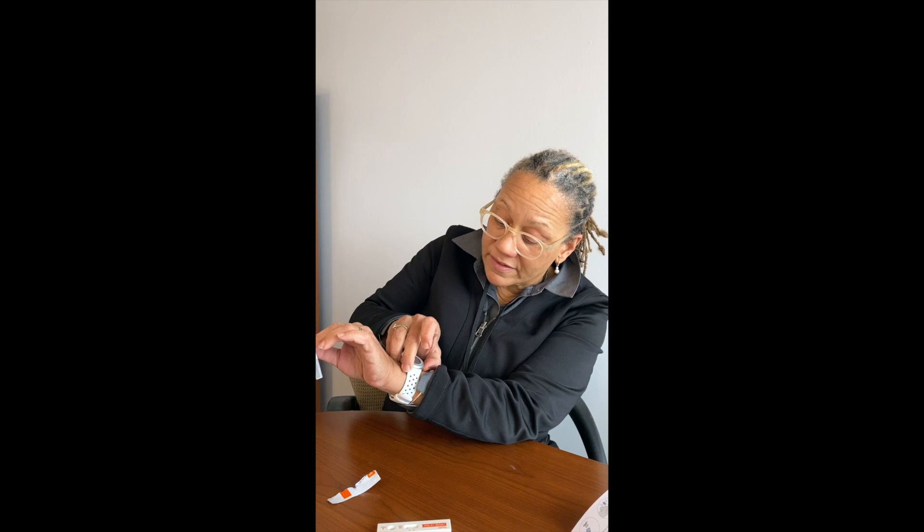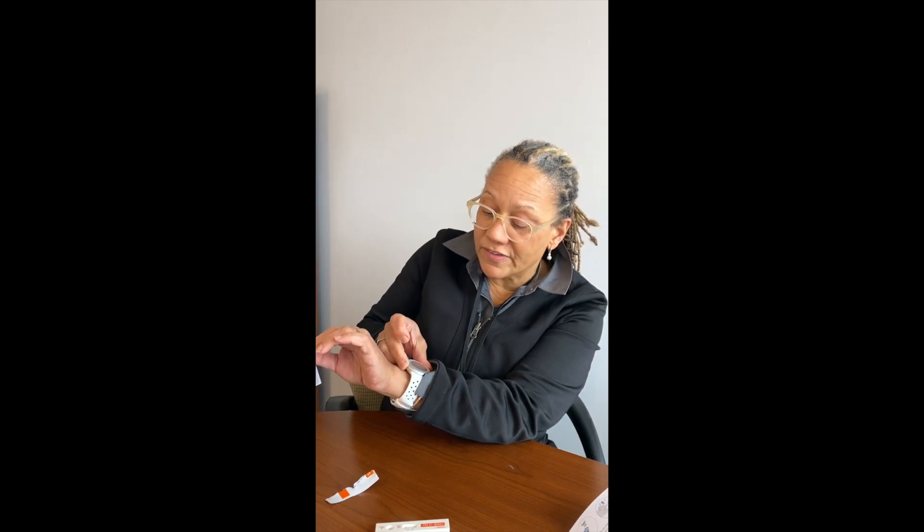I'm going to wait 15 minutes and set a timer right now. It's really important that you don't read it too soon, because it doesn't have time to develop, and you don't read it too late, because that will also give you an incorrect result. You really need to wait the full 15 minutes and then read it.